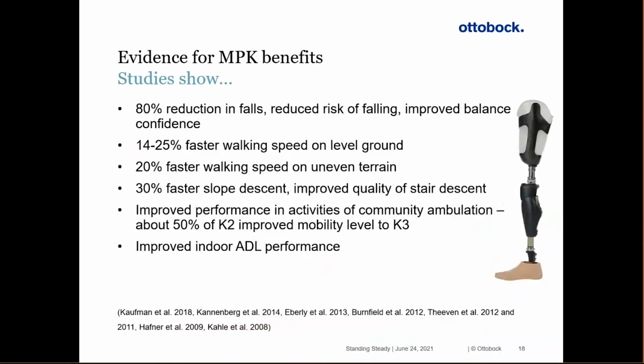So as we talk about microprocessor knees, again, in speaking with several clinicians that I know who fit a lot of bilaterals regularly, I've asked them, what mechanical knees do you use if they can't get a microprocessor knee? Surprisingly, many of them have said it's been so long since I've fit a bilateral user without a microprocessor knee. But there are certainly some scenarios where that's not an option, and there are mechanical knees that we'll talk about as well. But evidence does show that there are benefits for microprocessor knees.